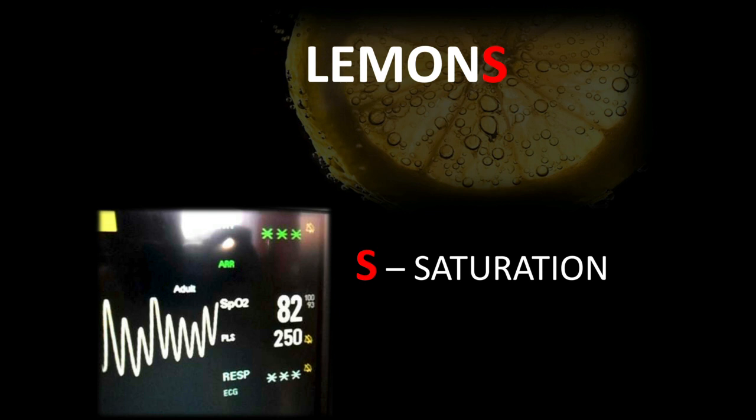And that's what's called SpO2 latency. It comes back to position, where that probe is located. And a lot of the research has come back to, hey, are we using the right equipment? A finger probe, we have seen, is not going to give you an instantaneous reflection of what that SpO2 truly is. You compare that to that Masimo ear sensor where it's placed on the earlobe. That's the core area, right?